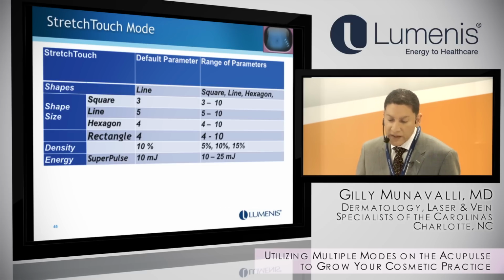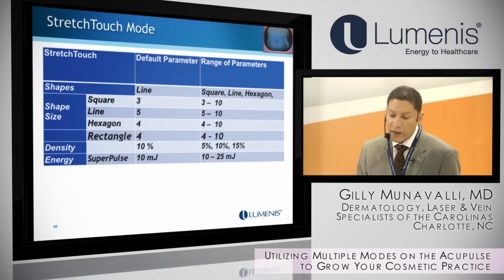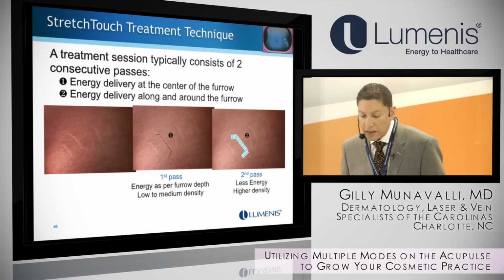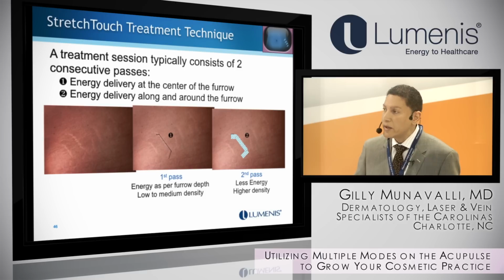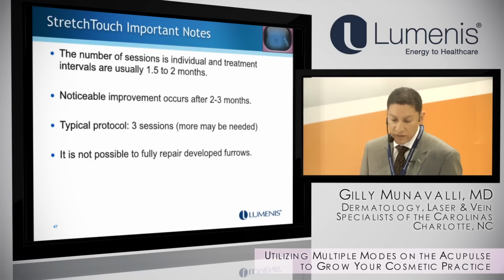So again, it helps to have different patterns because stretch marks can be wide, they can be narrow, and they can be fine. So it's nice to have different patterns to choose from. And so the way we typically do it is, I like to use low to medium density on the stretch mark itself, and a higher energy. And then if I'm sculpting off the stretch mark, I might change that a little bit because I want to get contraction around the edges.